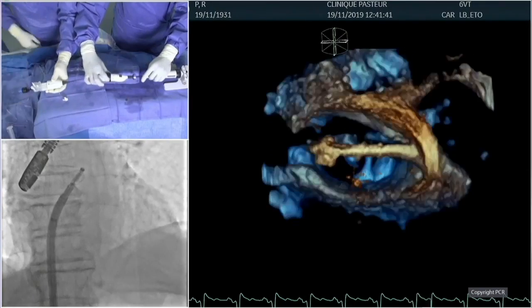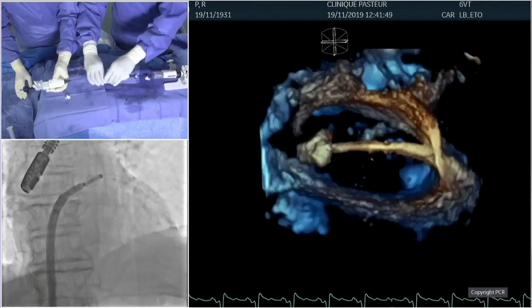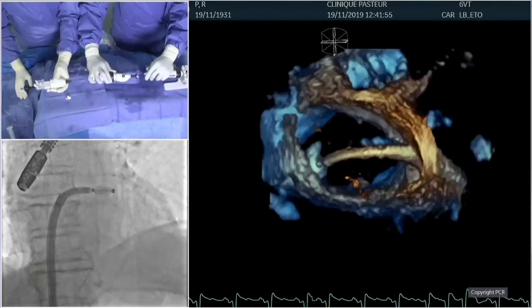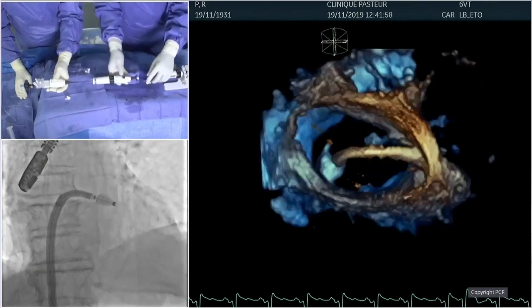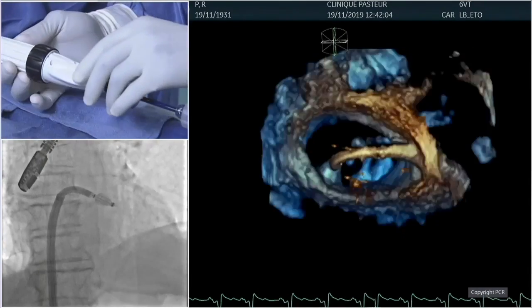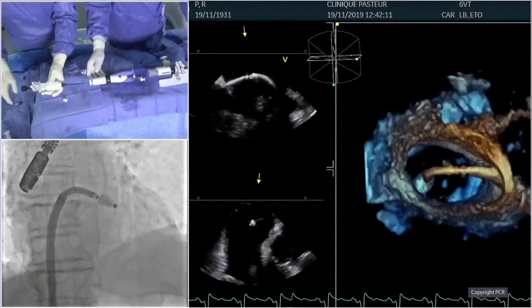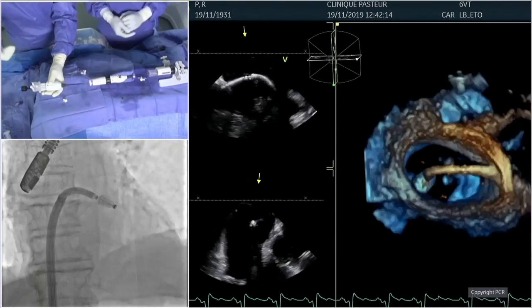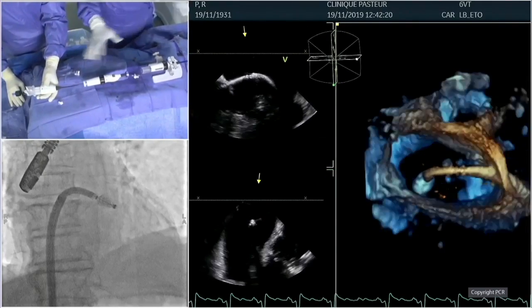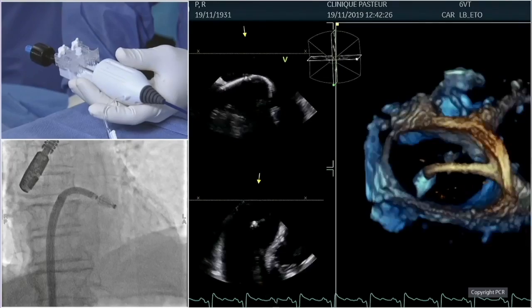Now the idea, as for any repair device, is to define and to find the correct trajectory, in order to dive at the correct point, our target, the mitral valve. So you're currently flexing to almost a 90-degree angle between the tip of the catheter and the guide. And maybe now, Didier, we have in 3D a beautiful view that will help everybody understand how you can control this device in 3 dimensions. Definitely. We are still in our early phase of experience, but we've been quite surprised by the freedom of movement that you can achieve with the PASCAL.